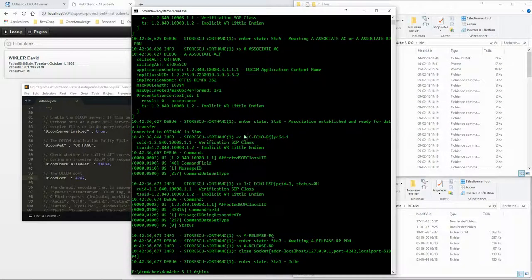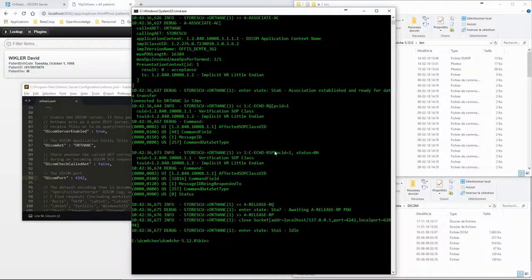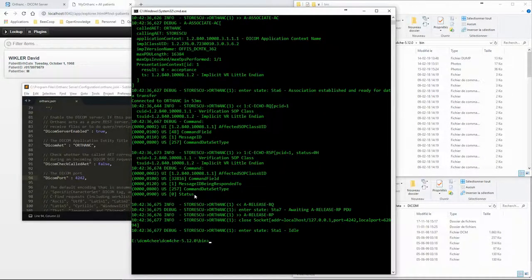The associate has the status 0, meaning that the operation was successful. We then have the echo request and the response, which has the status 0, meaning that the operation was successful.